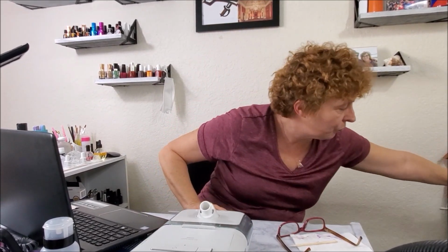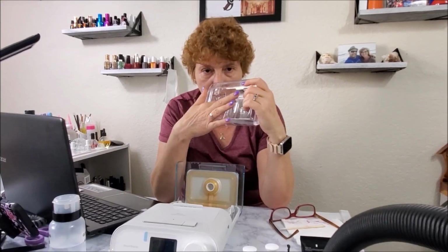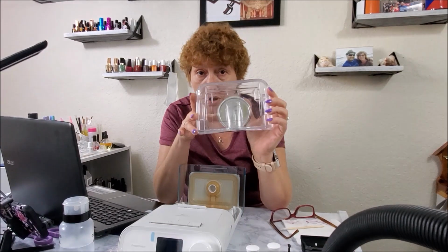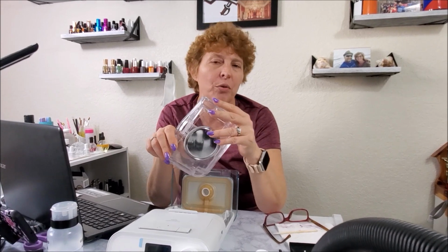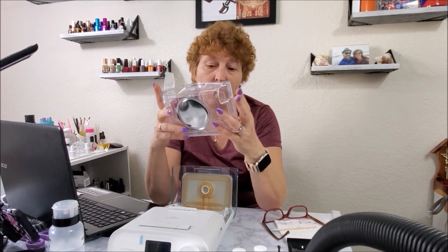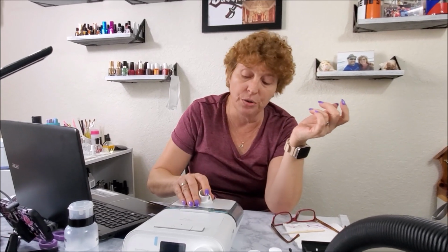So with that in mind, if you stop and think back, there have been times that I've gone to clean this out and I have found like black soot, like little black particles in here, or something floating on the water. And I do my own distilled water, so I know there's nothing in that water. I never really thought too much about it, other than, well, maybe I left the lid open too long and dust got in it. So maybe that wasn't the issue.